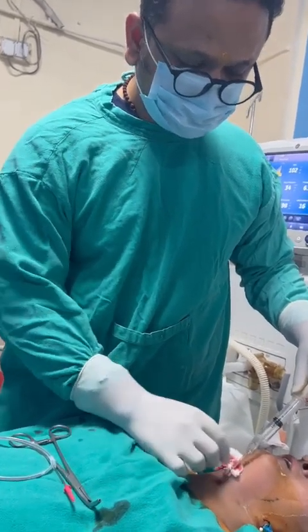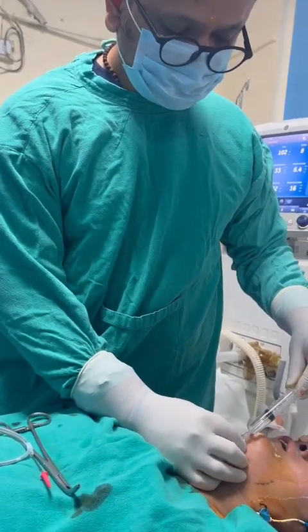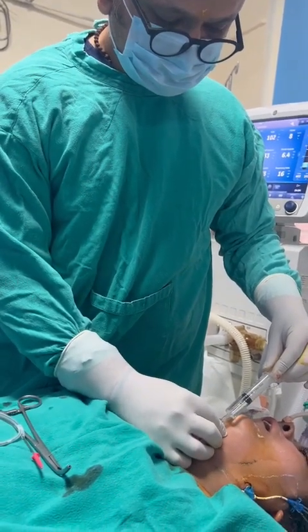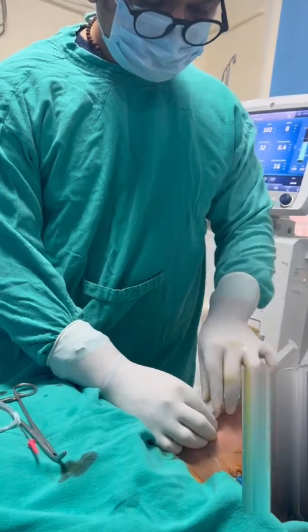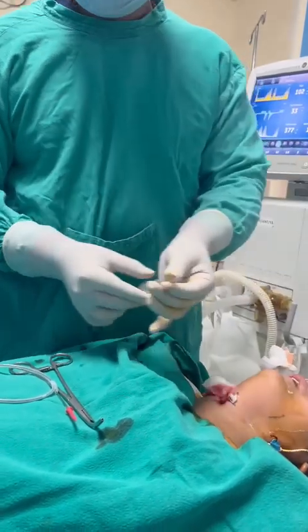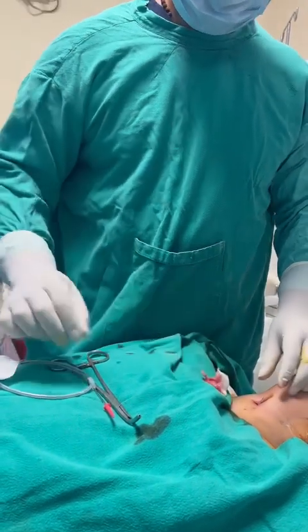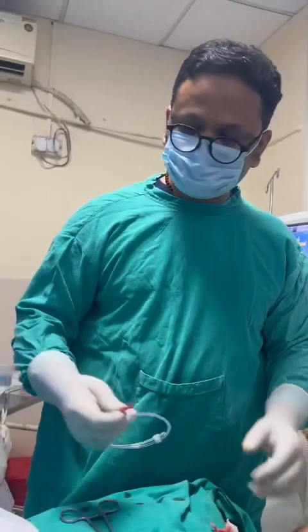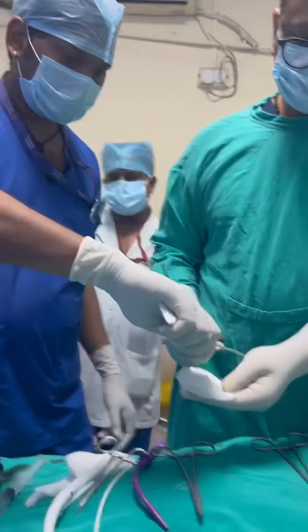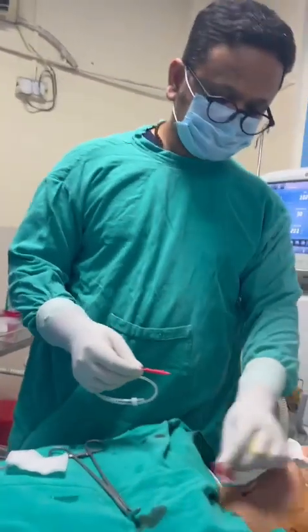Inside, it means the tube is overlying this one. We will see just in case where we can negotiate. So this is actually a tricky thing, not so easy, because negotiation requires a lot of proprioception. Blood pressure 166/99. Give 3 ml of propofol.